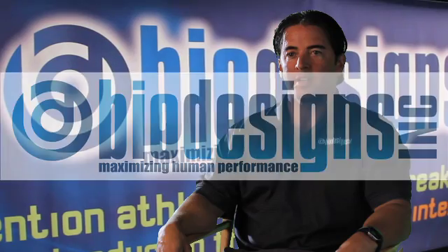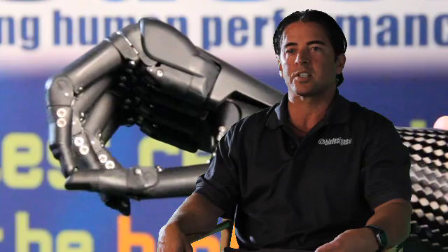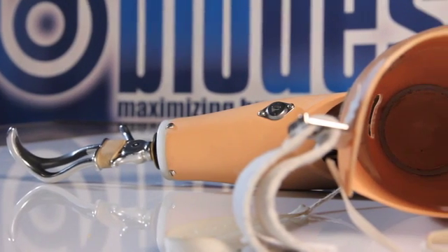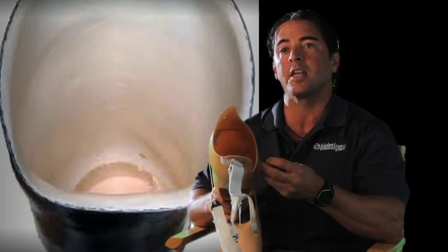When we talk about prosthetic technology, we typically think about the fancy feet, the carbon fiber energy storing feet, the microprocessor knees, myoelectric hands. It's seldom we actually talk about prosthetic socket or interface technology. At Biodesigns, we feel that is the most important part of a prosthesis because that is the core of where all the motion begins. This is a typical above-the-elbow prosthesis. What you see is a fairly generic shape, and that's because prosthetists all over the world are focusing on fitting the limb.